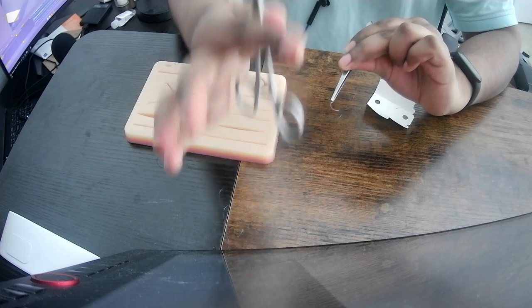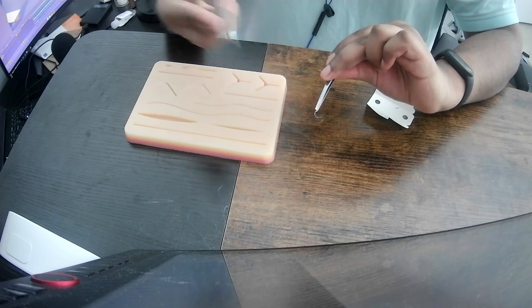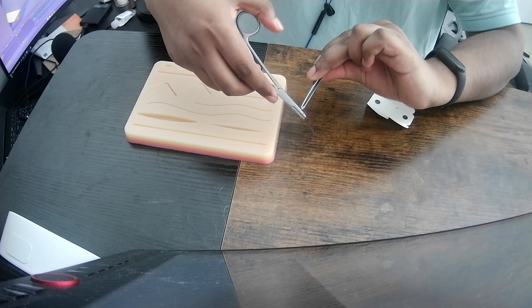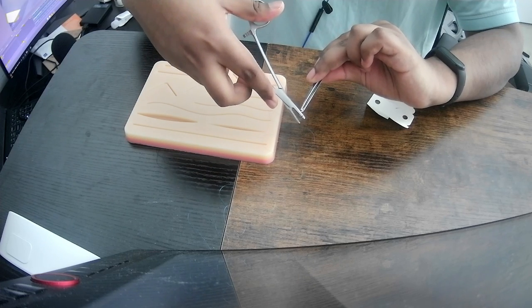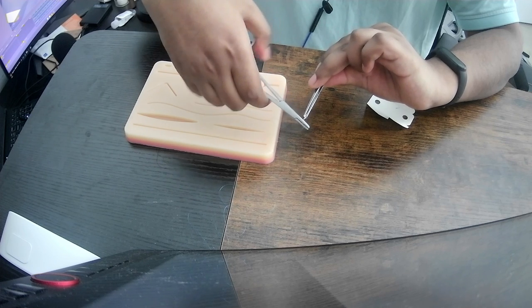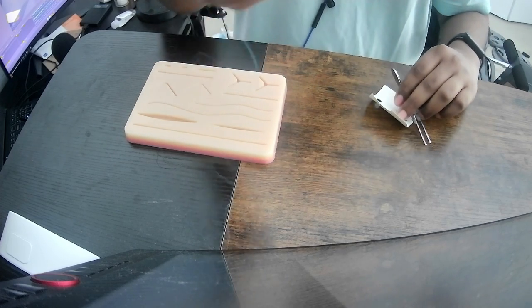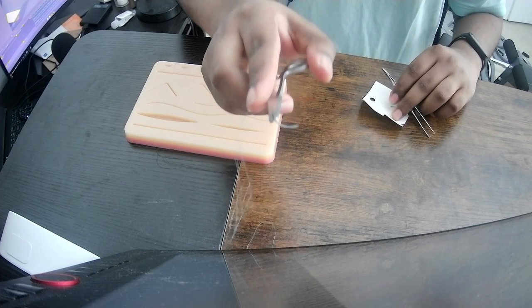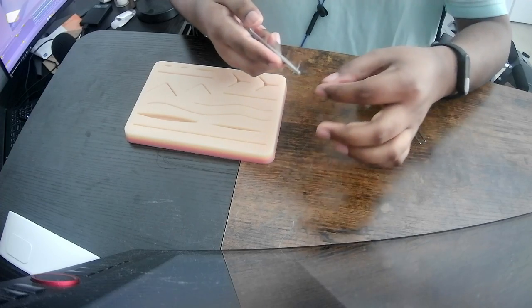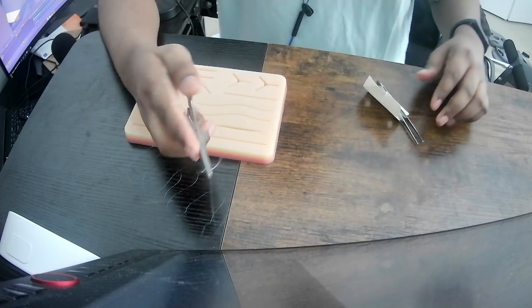Okay, so I got my needle driver unlocked. Apparently I'm allowed to load it anywhere in the curve. Let's try the one-third here. I guess I should do it at 90 degrees. I just had to use some more force with my palm. Nice, I did it. Okay, now it's very secure. I can palm it. Oh no, wait, I didn't do it. Did I? Okay, I have to be careful with the actual suturing so it doesn't get in my way.